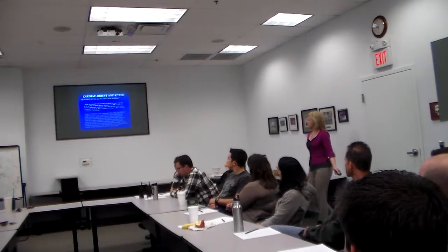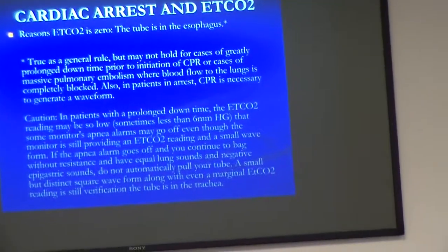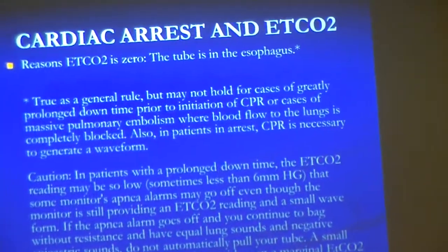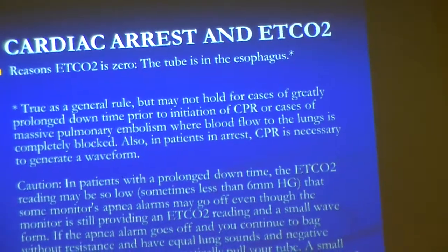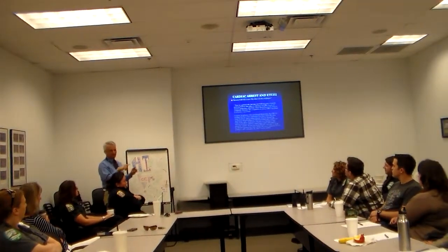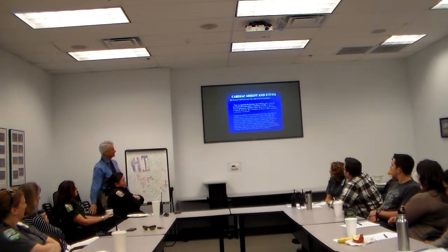Okay, so our cardiac arrest and end-tidal CO2, the reason that the end-tidal CO2 would ever be 0 is because the tube's in the esophagus. If you get a 0 number and you just have a straight line, usually your tube's in the esophagus or you're not even ventilating your patient at all. Some of the waveforms for misplacement, you'll go, well, wait, there was a little blip there. That's just a burp, okay? There's some CO2 that got into the stomach, but you will not get anything sustained. So don't let that little blip fool you. You're going to see it quickly flatline out. You can't store that much CO2 in your stomach.